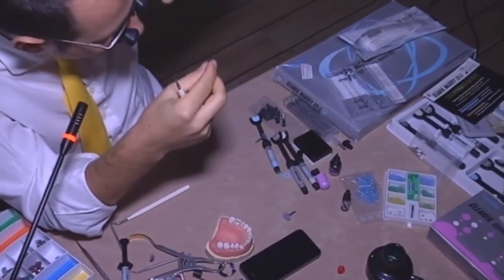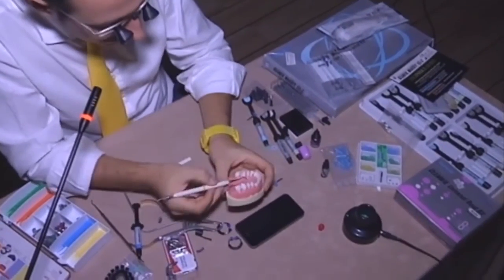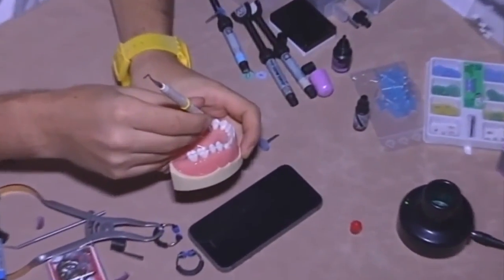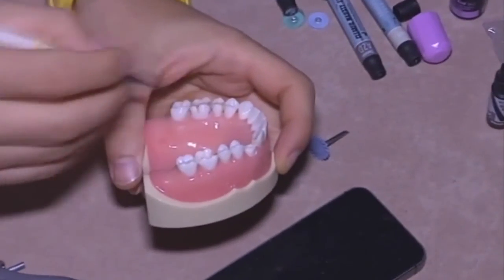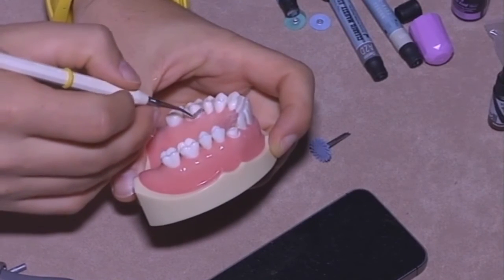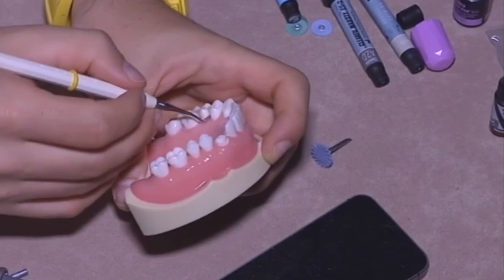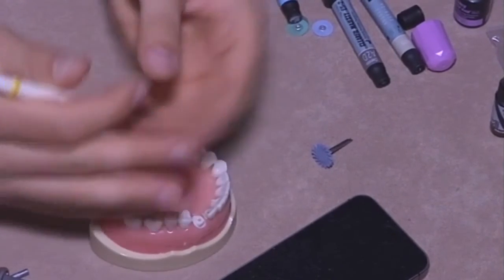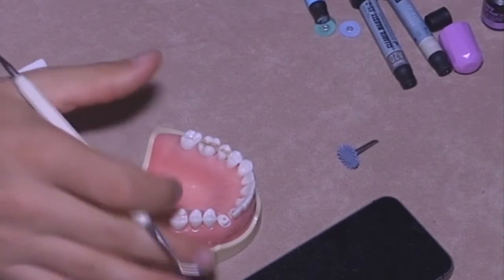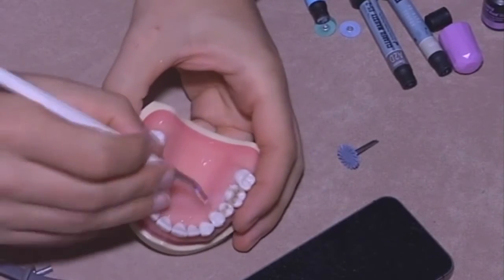So I have thinner interproximal strips that can pass easily down the proximal contact in order to remove eventual excess of composite here and here. Another tool you can use to remove the excess here is the scalpel. The number 12 scalpel, which is a round shape, and you cut there and you remove the excess there.